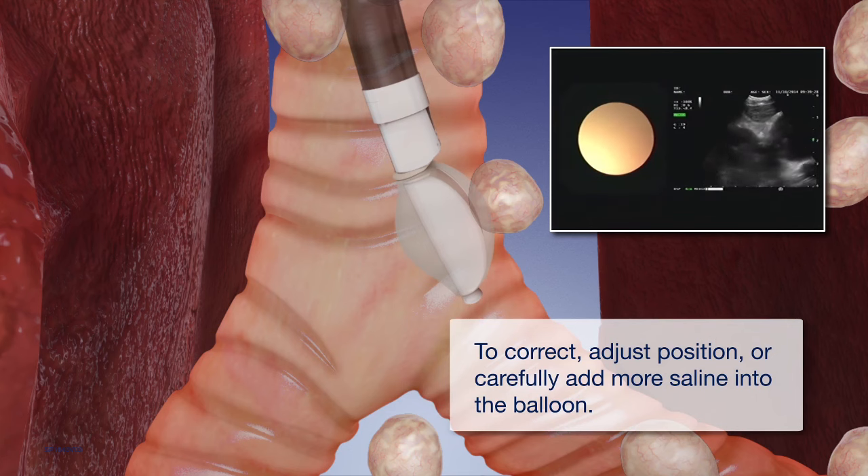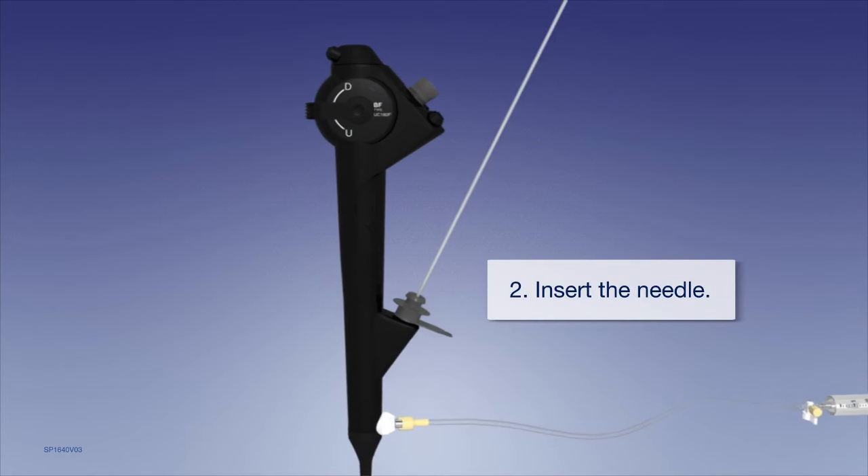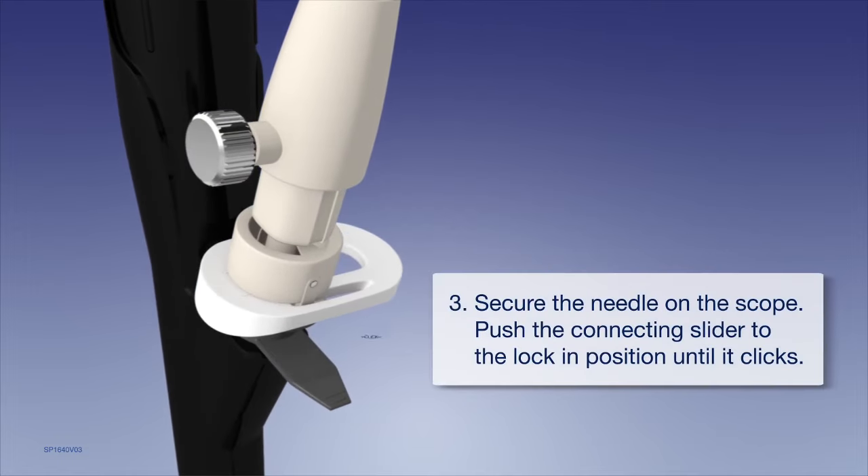Once the ultrasound image is obtained, ensure that the EBUS scope is in neutral position prior to insertion of the Olympus VisiShot EBUS TBNA needle. Then, insert the needle through the working channel and secure the needle on the scope. Push the connecting slider to the lock position until it clicks.